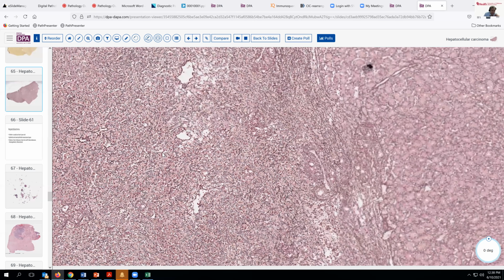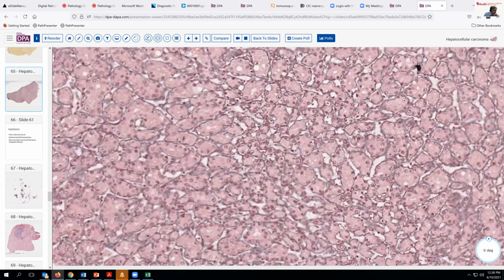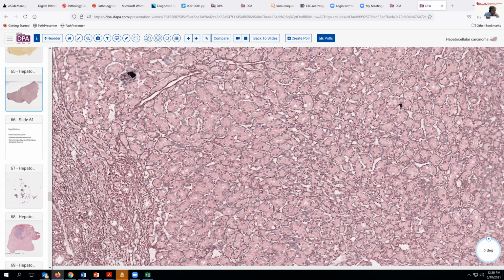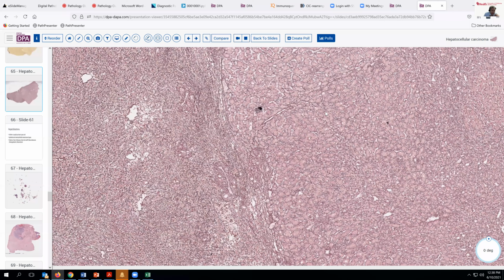In contrast, when we come into the tumor, you can see that here the reticulin is highlighting rounded groups, and it's highlighting the nests of cells rather than the channels per se. And so this is an abnormal architecture, although subtly different, but it is an abnormal architecture that supports a neoplasm. The reticulin stain is, I think, most useful, like the CD34, in the well-differentiated tumors. With the poorly differentiated high-grade tumors, you're not going to be faced with the problems that you have with that.